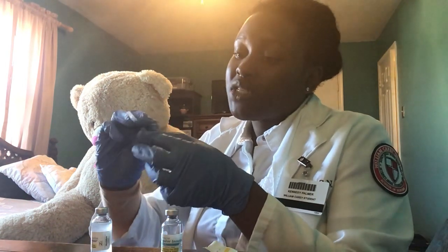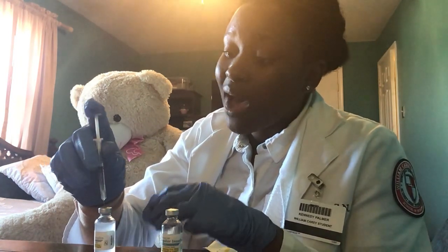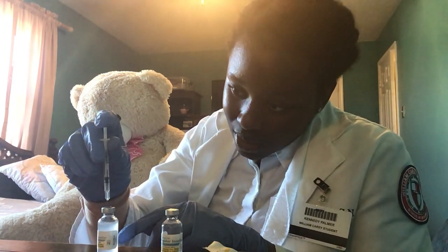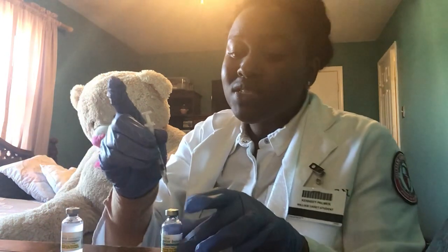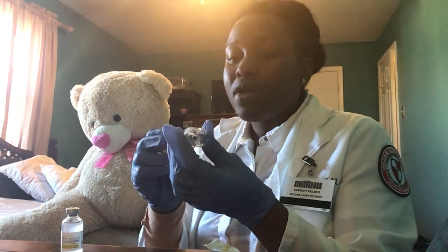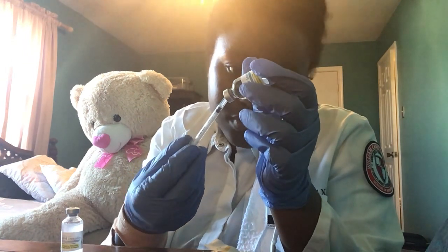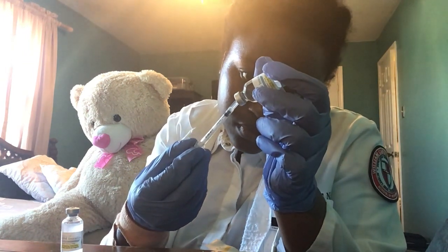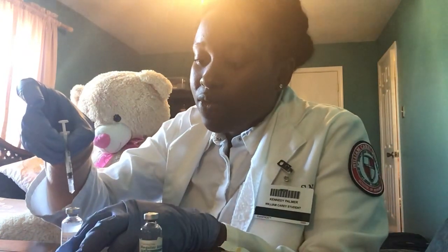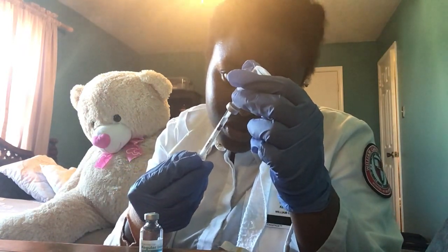Okay, and I'm going to inject 16 units of air into the NPH, making sure the needle does not touch the medication. Okay, and now I'm going to inject the rest of the air into the regular. Okay, and I'm going to draw up 6 units of the regular. Okay, and now 16 units of the NPH, which is 22 in total.